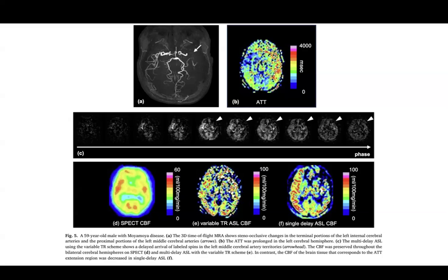Perfusion is standard. Even then, it has got a lot of fallacies because of the assessing software. Based on software, you can have very different results. Very few trials have actually used perfusion, so everybody is using automation.